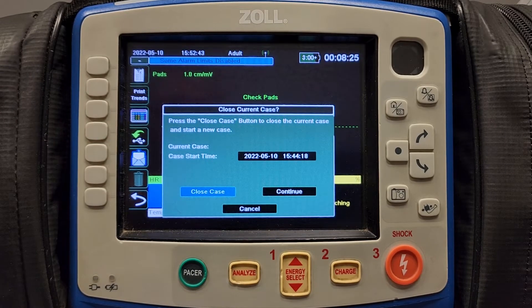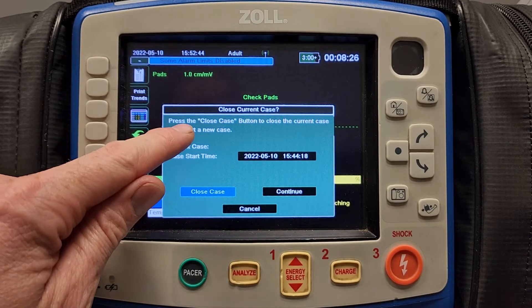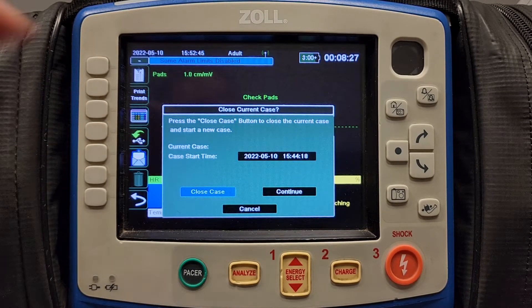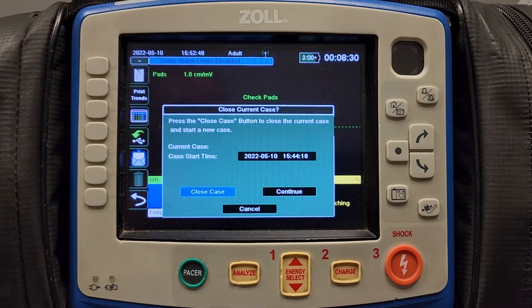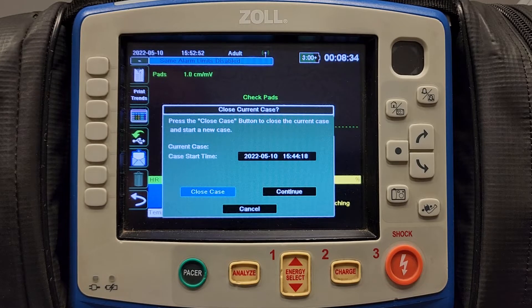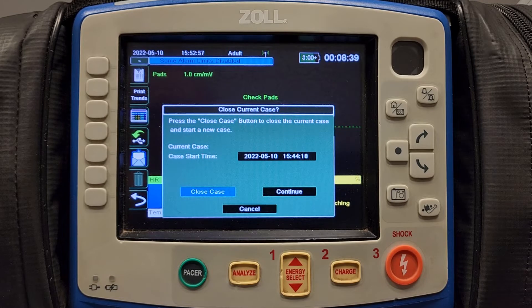This menu will prompt you to press the close case button to close the current case and start a new case. If you have just arrived at the hospital with your patient and you have not turned the monitor off, you have to close that case before those vital signs can be uploaded.